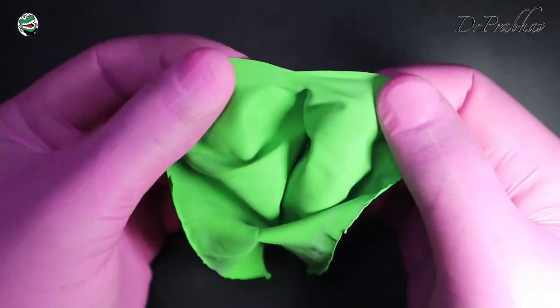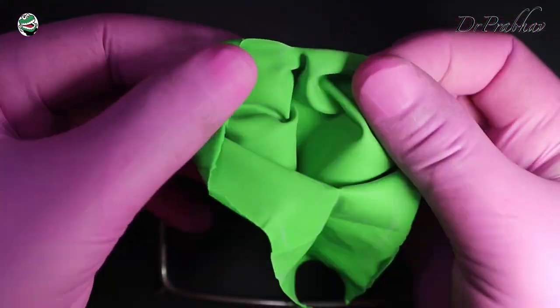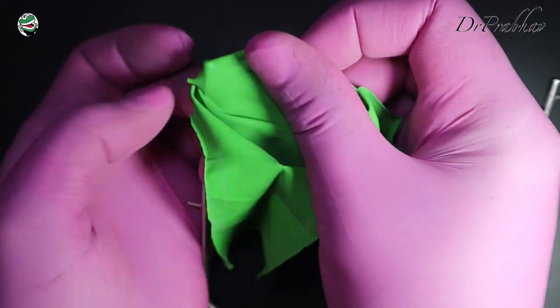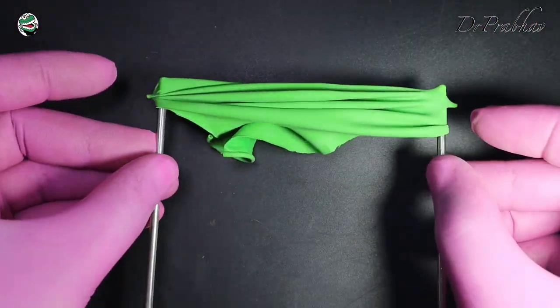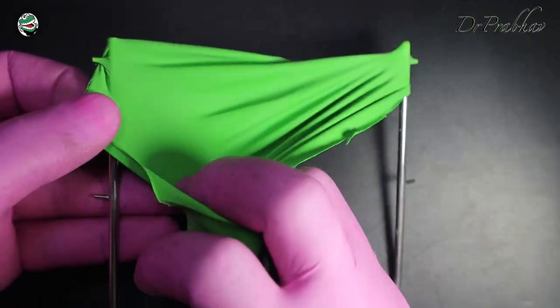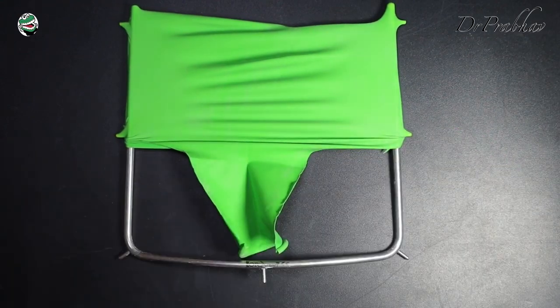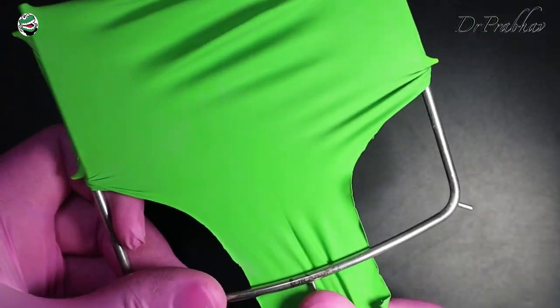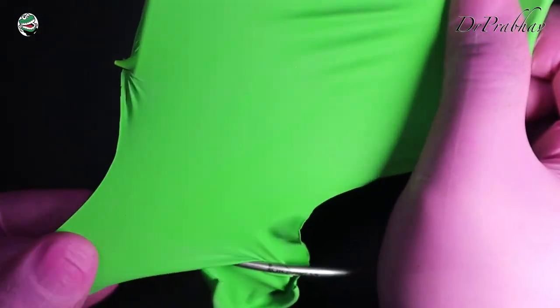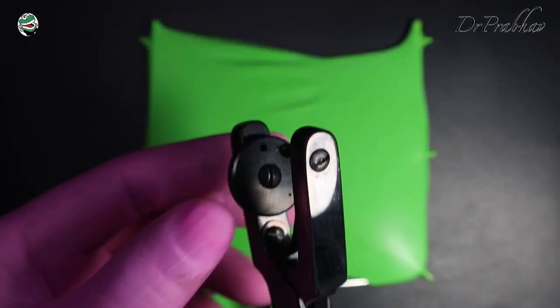So now after cutting, we can spread it and make it a rubber dam sheet. And now we will stretch it and engage one end on the rubber dam frame, and similarly engage the other end, and similarly we will proceed down. In a similar way, keep on engaging with the lower ends and remember to keep it tension free. Now engage it in the lower slot and subsequently finally engage it in the corner slots like this, and there should be minimal tension or no tension, otherwise the sheet would tear.